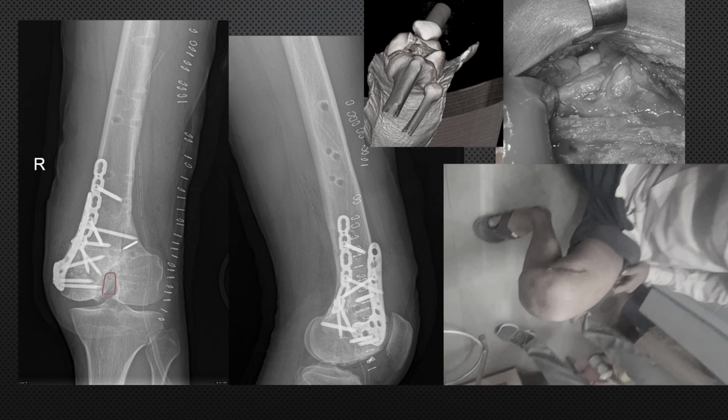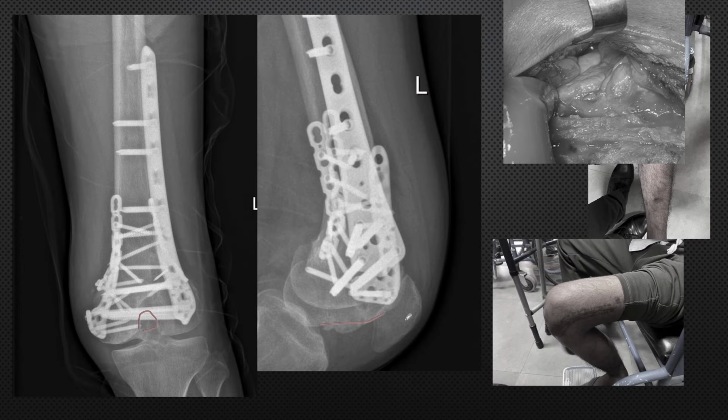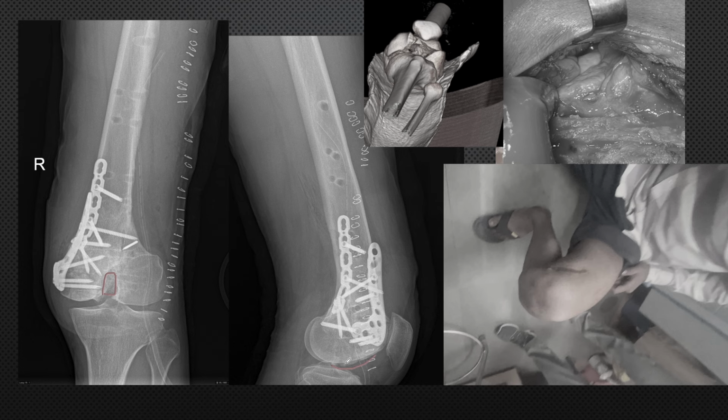And you see at 1 year the remodeling of the medial side is still happening. It has now become very smooth. Earlier there was some irregularity seen here, but now it has become smoother. So it is an ongoing process. You need to have good stability, and movements should be started as early as possible, because the movements help in healing of the cartilage. It allows lubrication of the joint as well, and it allows the healing of the cartilage as well.